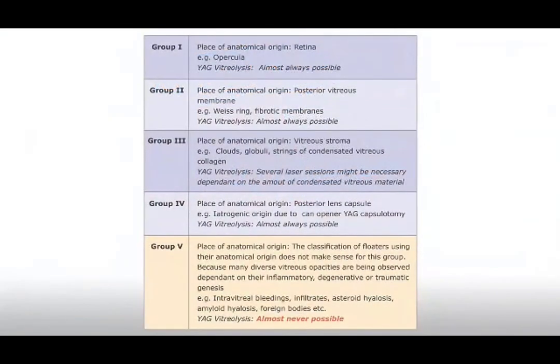Manifestation of vitreous opacities and possible subjective impairments are considerably variable. Therefore, not all vitreous opacities are suitable for laser treatment. A classification according to the histoanatomical origin of the vitreous floater material can aid the treatment decision and should be helpful for future research.